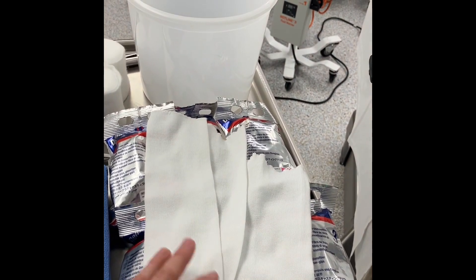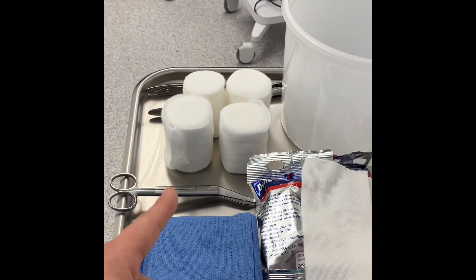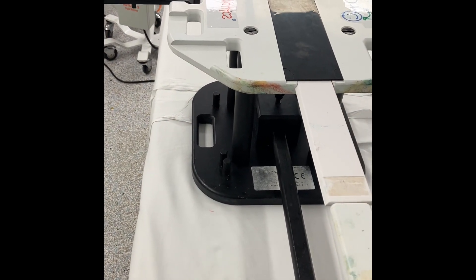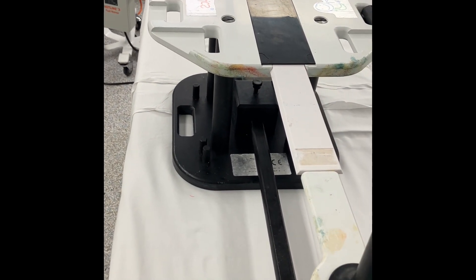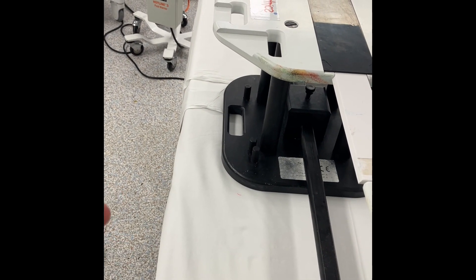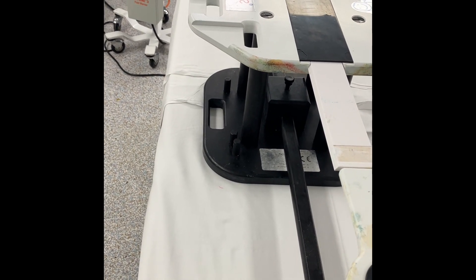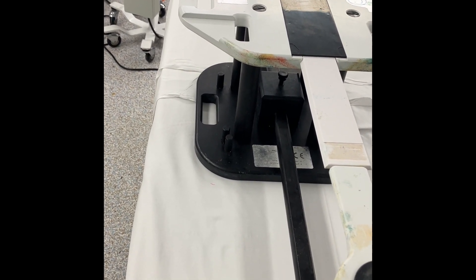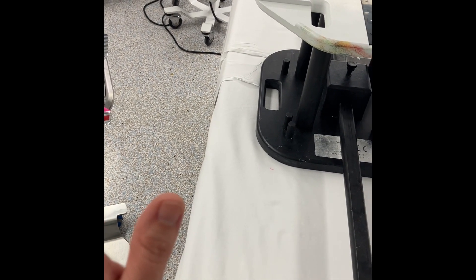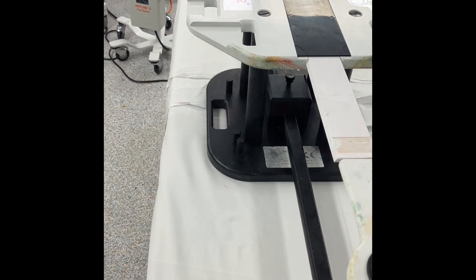Once they get those on, they'll start wrapping the waist and the leg with soft roll. It's important as a scrub tech that you are bending the patient's leg up enough so that they can sit down comfortably when awake but can also stand. So you want to be bending the knee, doing a bit of external rotation, and making sure that foot's at 90 degrees to the leg so that they can walk and sit — because they will be wearing this cast for six weeks, so you have to consider that.